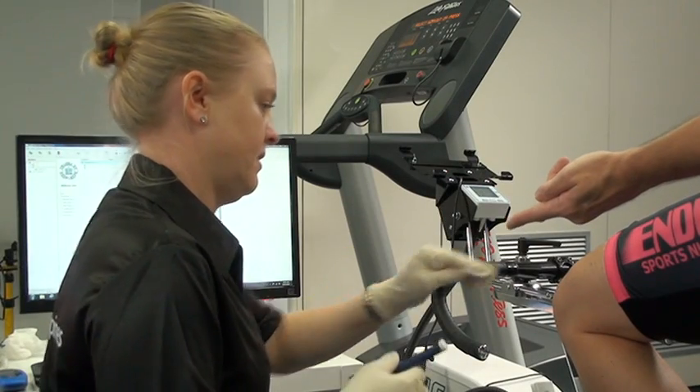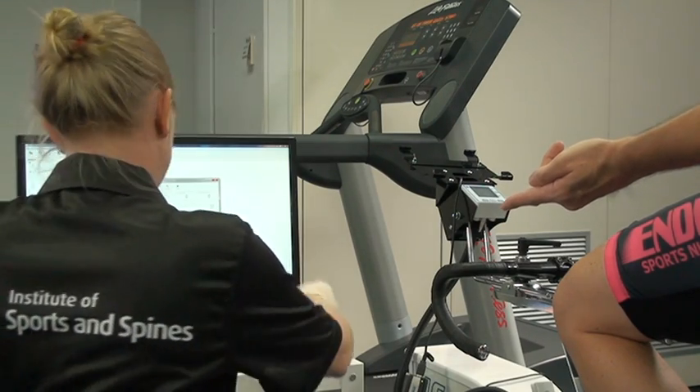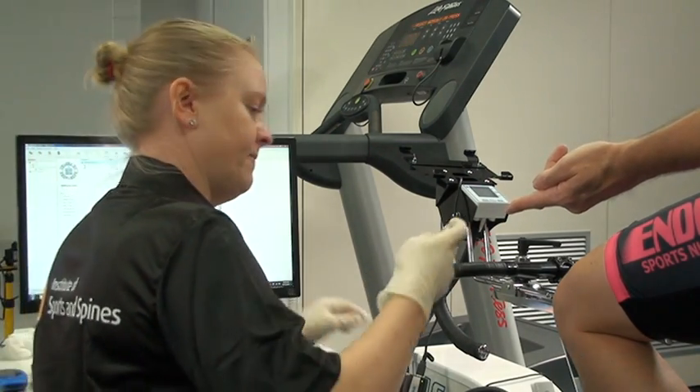I'm Don Williams again for the Institute of Sports and Spines. Today we're showing you a demonstration of a full max capacity blood lactate test.